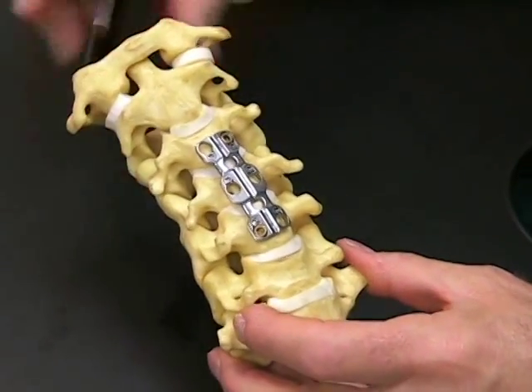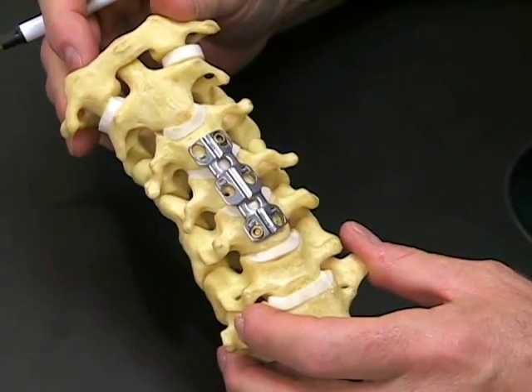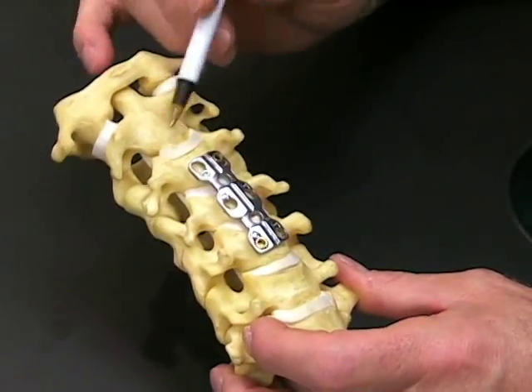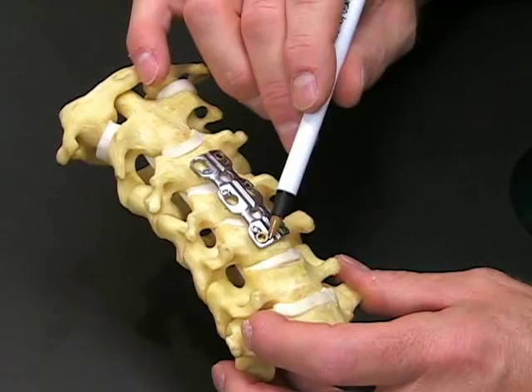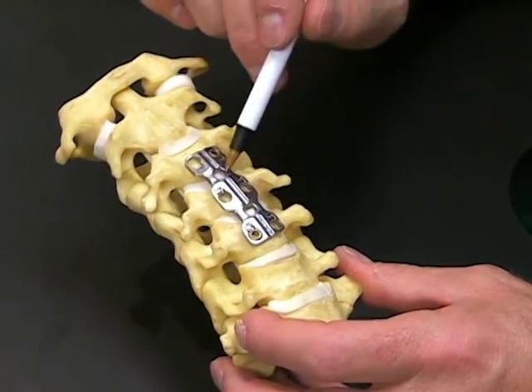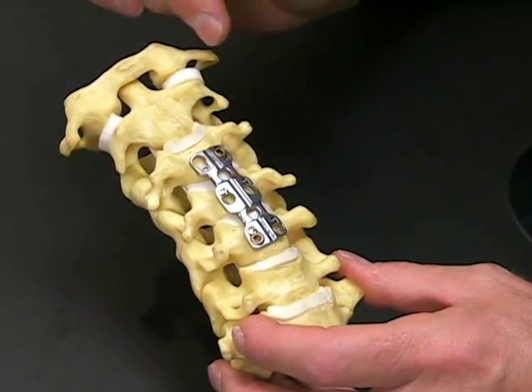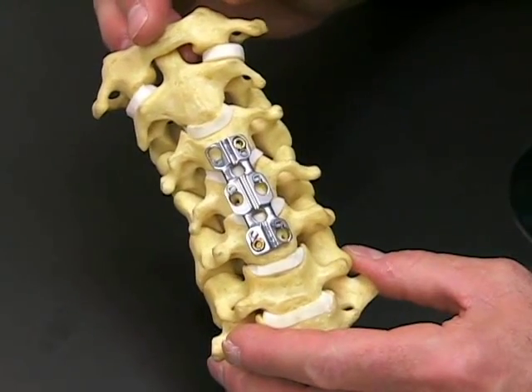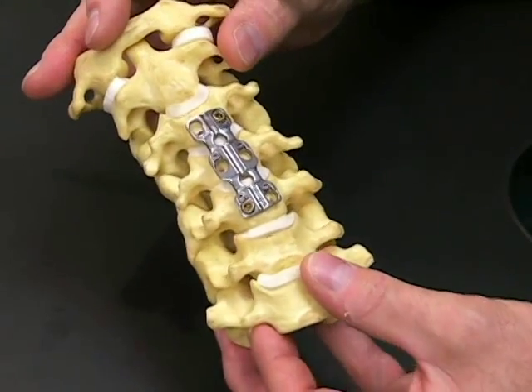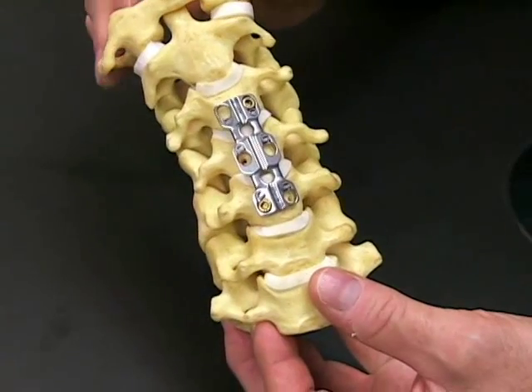This is a model of a typical plate that we would use. There are several plates and they all have the same function and serve the same purpose. This happens to be a two-level plate, and this plate model has one screw here and one screw down here, but at each level we would put two screws into the bone, and this is where the bone graft sits underneath. The screws generally have a lock-in mechanism to keep them locked in position so that they don't pull out. And as you could imagine, when the plate is in position, the motion above and below the plate continues. However, right at the level of the plate there's no motion.